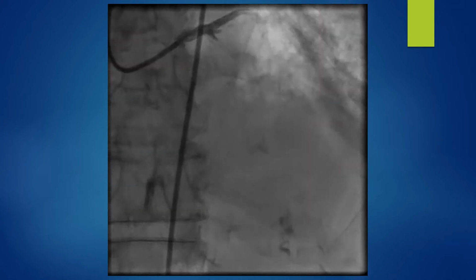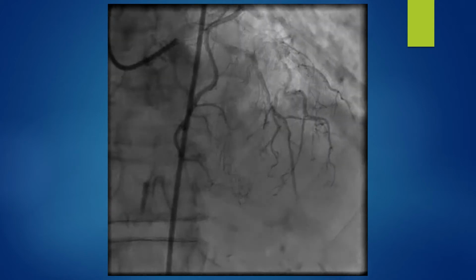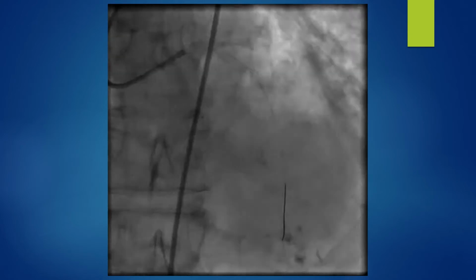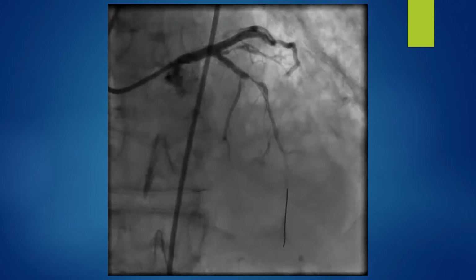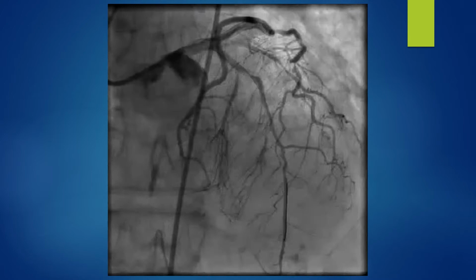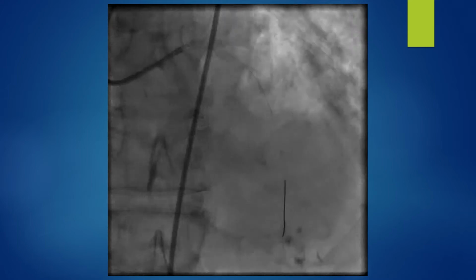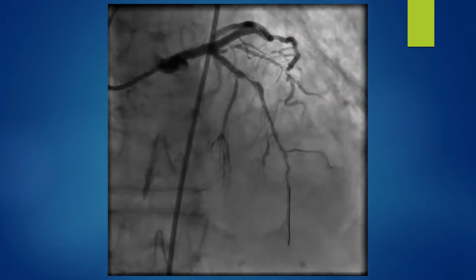I used an XB guide, 6 French, and this is the first shot after the guide engagement. After that, I used the Turnpike LP to pass the workhorse wire across the lesion in the LAD. After that, I exchanged the workhorse wire with the Viper wire. I took out the Turnpike LP. I performed the orbital atherectomy of the mid LAD lesion. Unfortunately, I don't have the images of atherectomy. I did not save them.